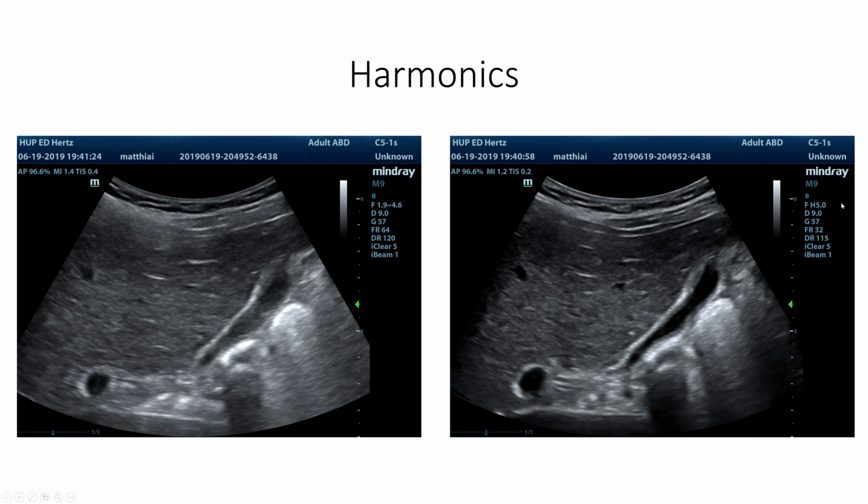So that 5 megahertz is the second harmonic. 2.5 megahertz is the first harmonic. Don't worry about that too much, but it's sort of like, if you're playing the piano, going up an octave from the note that you're playing. Hopefully, I don't know that much about music, but hopefully that's an accurate comparison if there's any physicists listening to this talk.